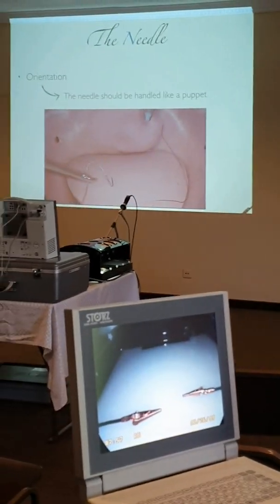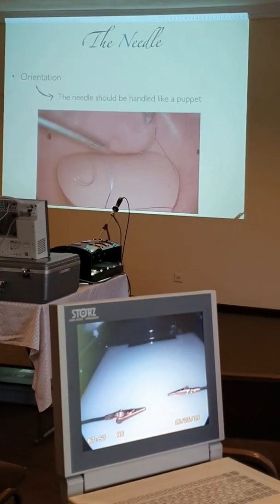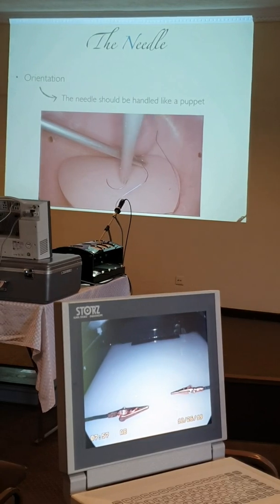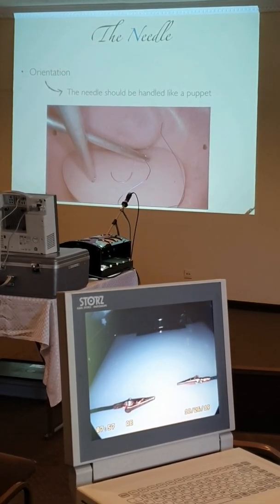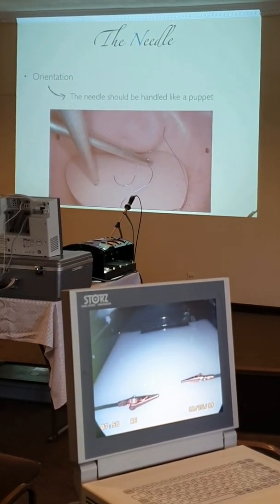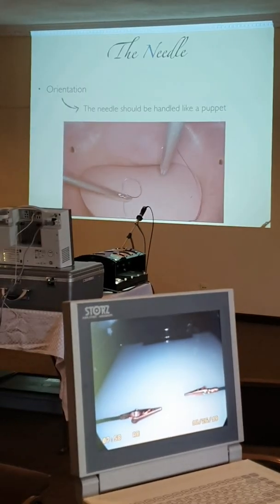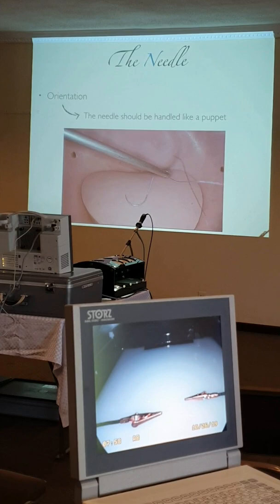And you put the needle in the position that you have to make to load the needle into the needle holder to make the suturing. Here it's in a position you can look for the direct position with the right hand. You can put first here in this situation, or you can put it in the left hand, the left side.